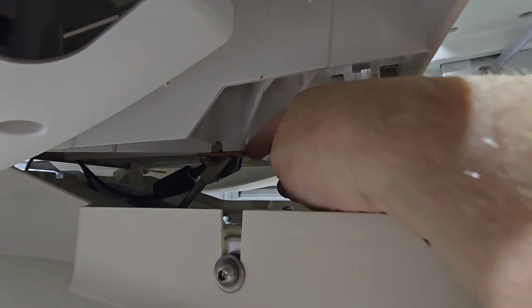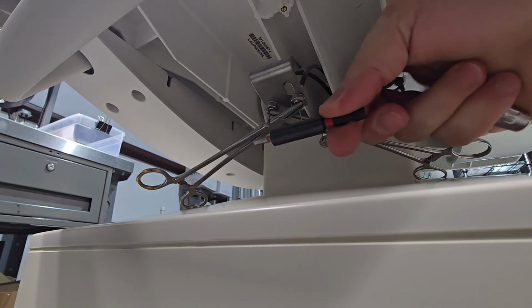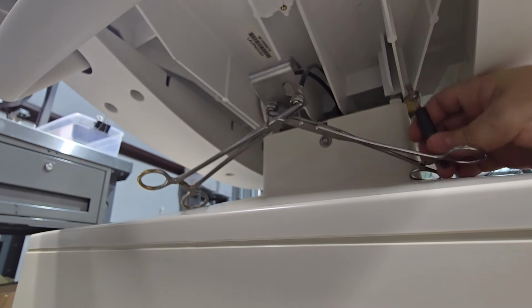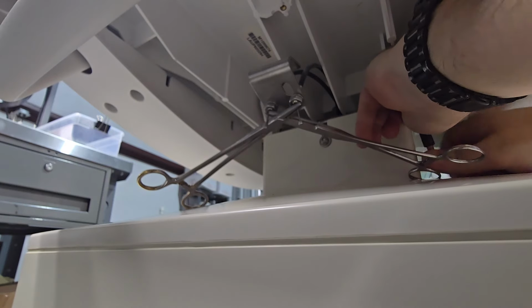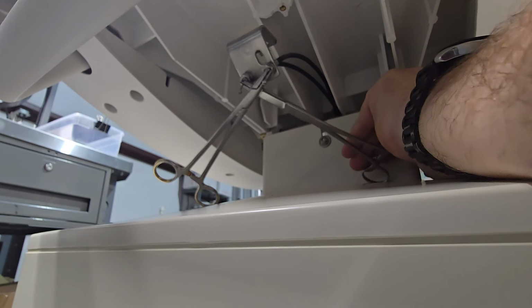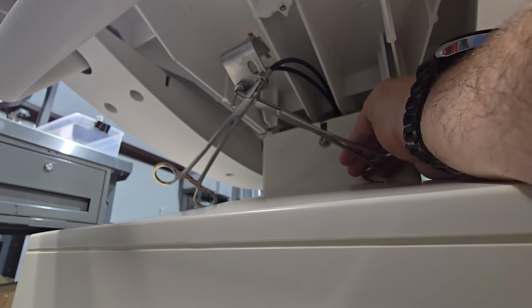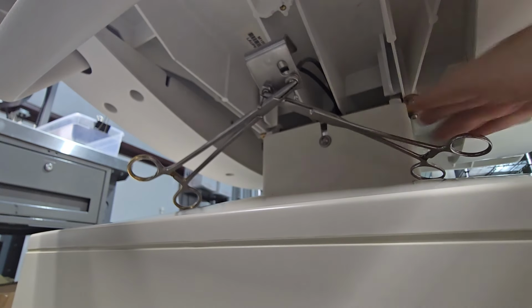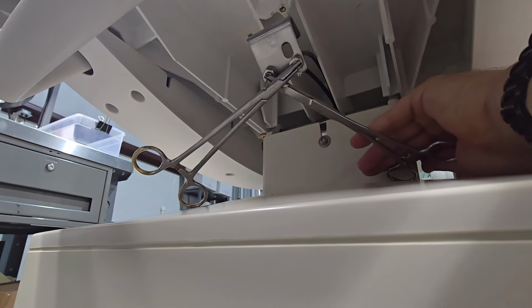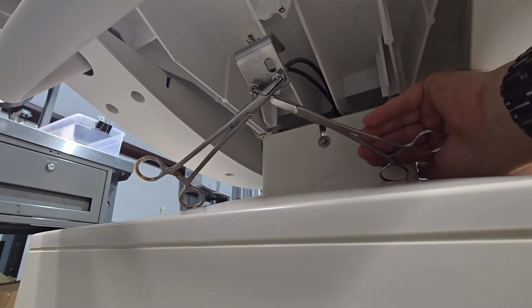Next, we're going to put the fasteners in here and up there, and we're going to screw it down. For this step, we're going to use the short extension again, along with the ratchet. Put the fastener on, place it up in the hole, and start threading them in. Now these ones here, we can go ahead and snug up once you get a side in correctly. Remember, you don't have to go too tight. All you're doing is compressing that lock washer.